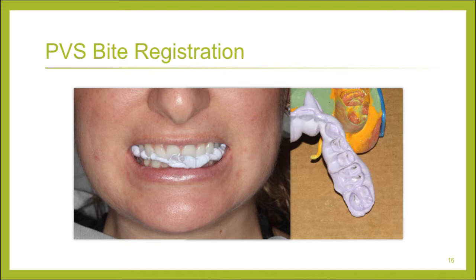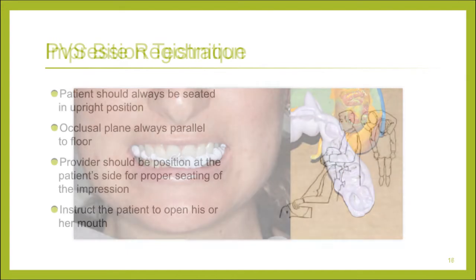So we need to see those little see-through areas. Sometimes when they come out, I'll hold it up to the light and look through it to make sure that I can tell where the patient has bitten together.